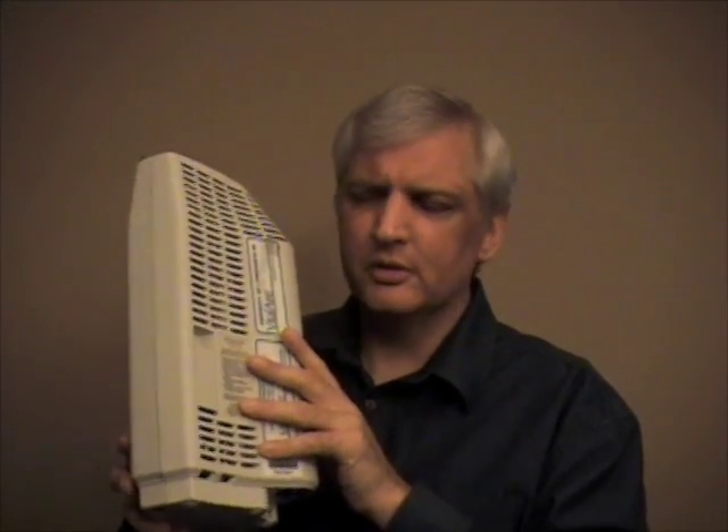It could actually be liquefied oxygen, which is — I think it's 185 degrees below zero, something like that. And it's so cold that if you touch it, it'll give you a severe, severe burn immediately.